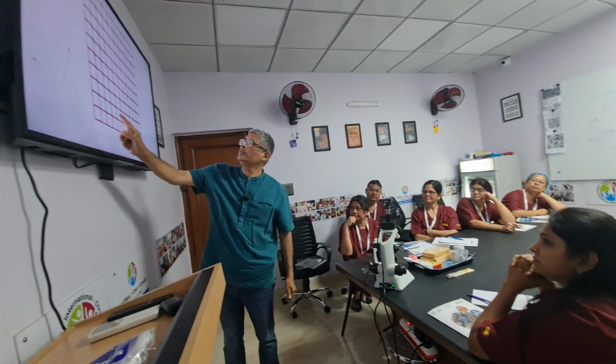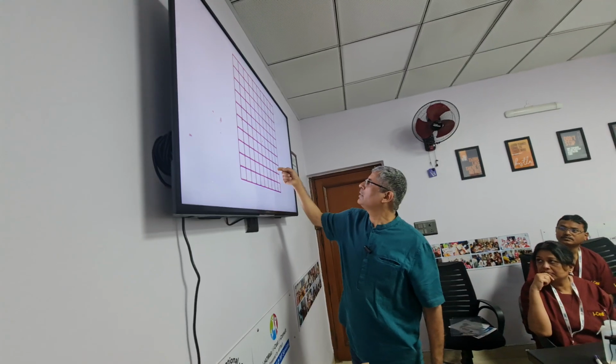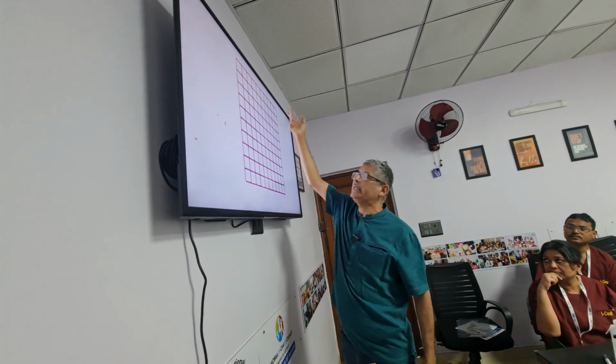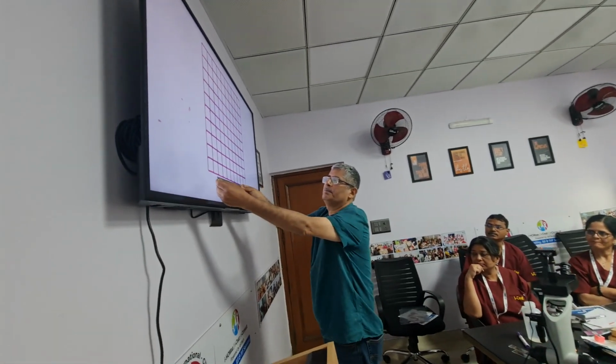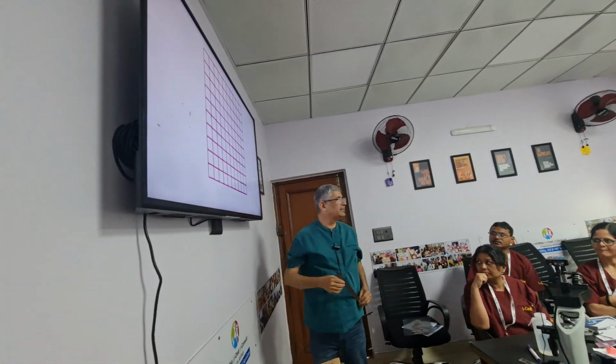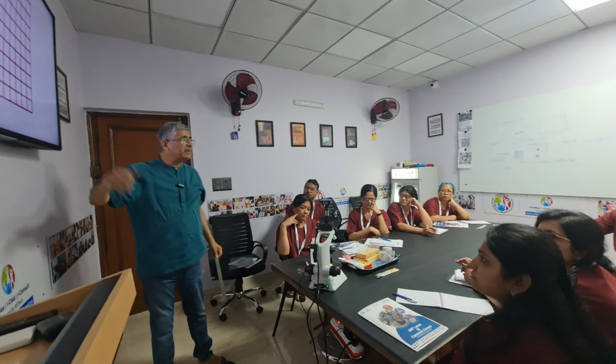So 1, 2, 3, 4, 5, 6, 7, 8, 9, 10. It is a 1 millimeter by 1 millimeter grid. One square is 0.1 by 0.1 millimeter. The chamber depth here is 10 micrometer. So at 4x, I'm getting this information for you. In case I put my sperms, I will see the sperms in 10 squares and get my answer. Are you with me or not?